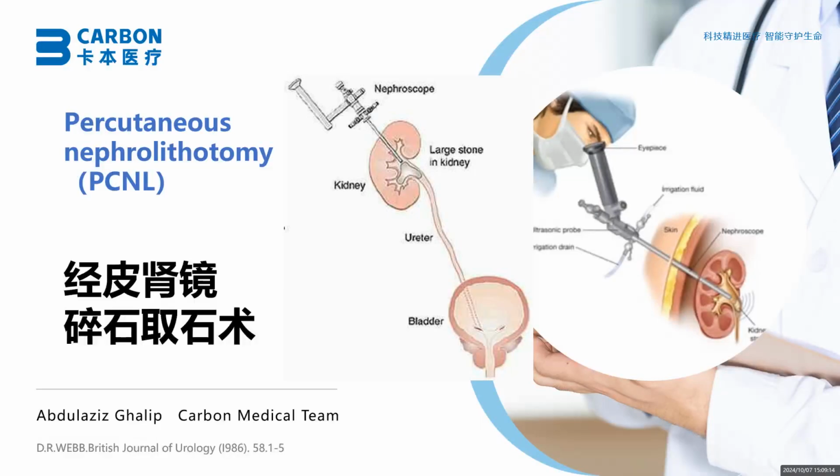Hello everybody. Today we are going to learn about PCNL. This is the operation for removing kidney stones or upper ureteral stones.